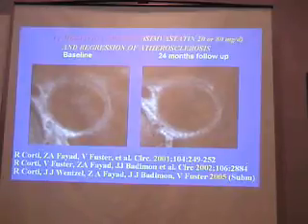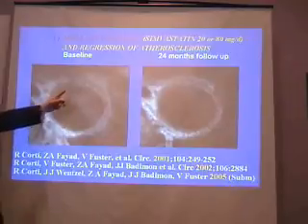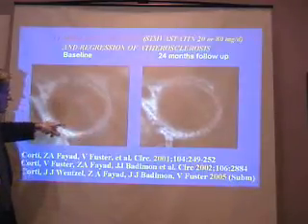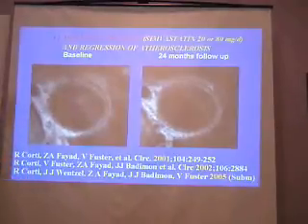You can characterize the tissue, at least in the main arteries, with MRI. You are in a fantastic platform to begin to apply drugs. And we began, as you probably know, by looking at carotids and aortas with some fat here in black, and we began to give simvastatin 20 versus 80 milligrams in 50 patients.